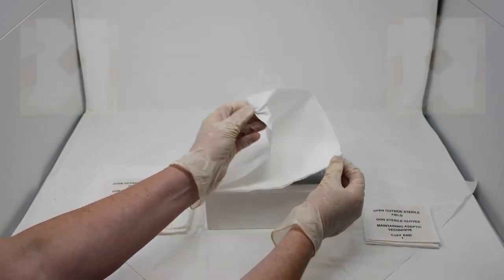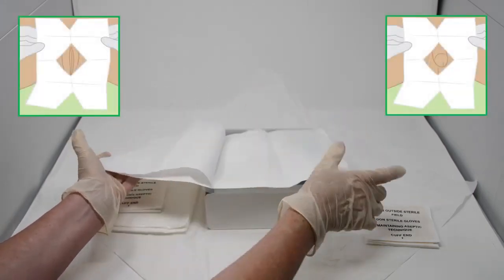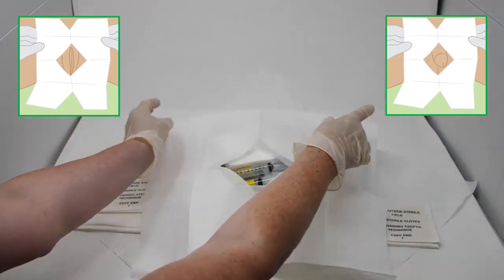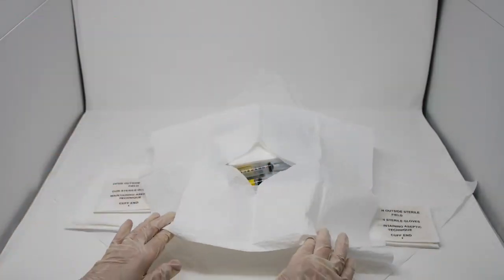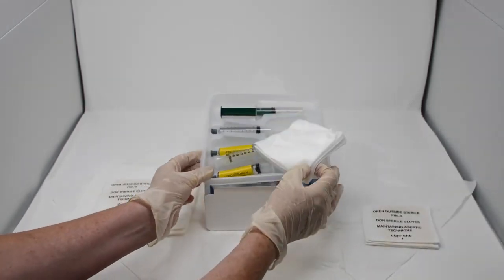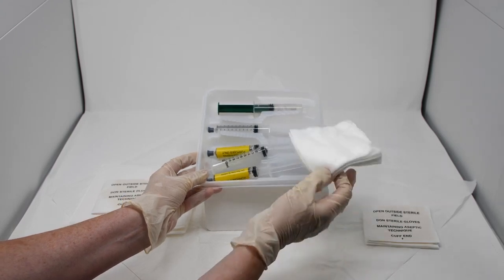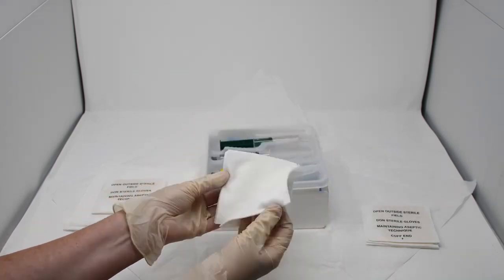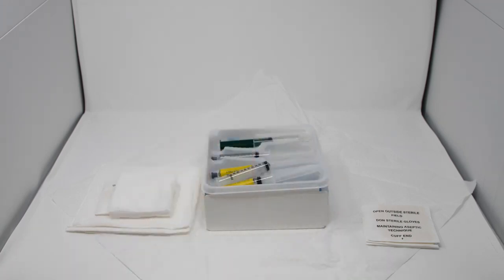There is a dignity sheet that is pre-cut with a diamond-shaped hole, removing the need for you to tear a hole yourself. Next is the tray that contains the syringes and can also be used as the galley pot. This part includes five 10cm x 10cm sterile gauze pads for washing and cleaning.